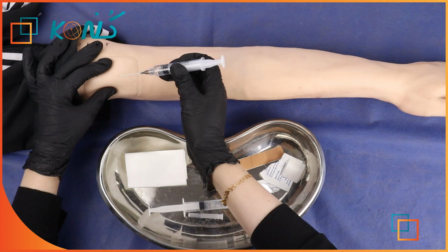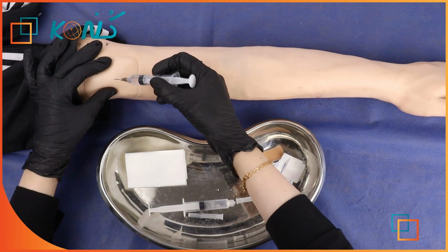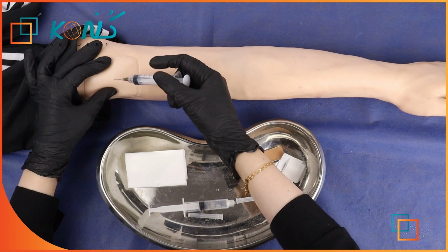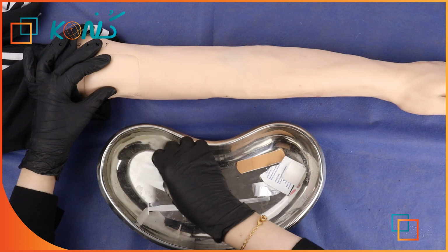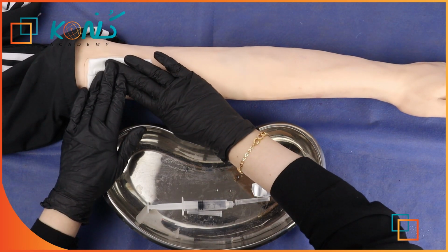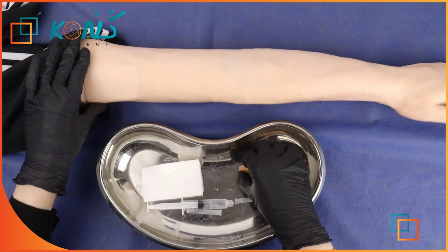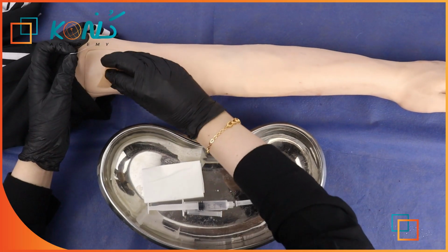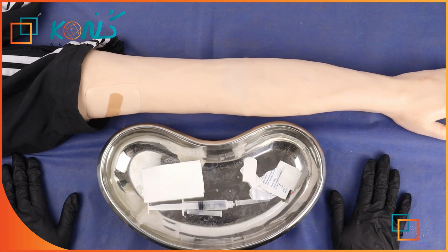Before inserting the needle, warn the patient, sharp scratch coming, then insert at 45 degrees, give the medication, remove, dispose in the sharps bin, apply pressure, do not rub, and then apply plaster. This is how to do subcutaneous injection.